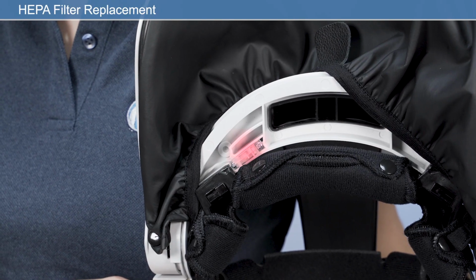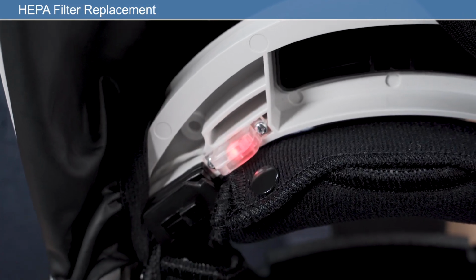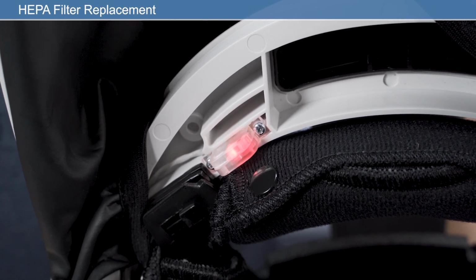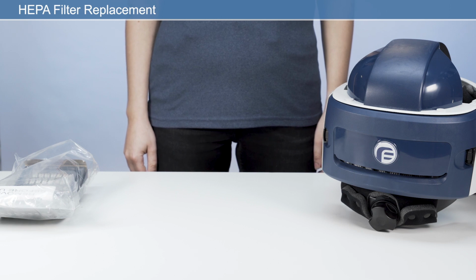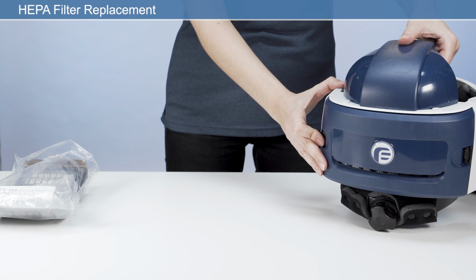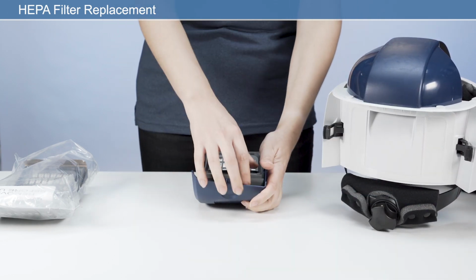When the status indicator LED illuminates red, further investigation is required regarding the condition of the filter and/or the battery. If no fault is found on the battery, the HEPA filter must be replaced. Open the filter cover by releasing the latches on both sides of the respirator. Remove the filter cover by pressing the two filter latches. Remove the contaminated HEPA filter and pre-filter as applicable.